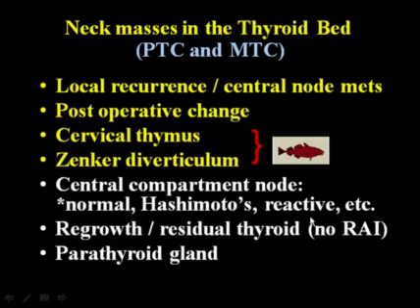Sometimes certain patients will have more residual thyroid tissue. And a lot of patients these days are not undergoing radioactive iodine therapy. Those ATA guidelines have new recommendations on who is eligible or who should be getting radioactive iodine. So in this case, we may see more and more of these cases of residual thyroid tissue. And rarely, you might see a lesion in the thyroid bed, which will turn out to be an enlarged parathyroid gland. I would say that most of these patients have elevated calcium and parathormone and tend to be symptomatic, and it's known prior to them coming for their scan. But occasionally you'll see one of these.